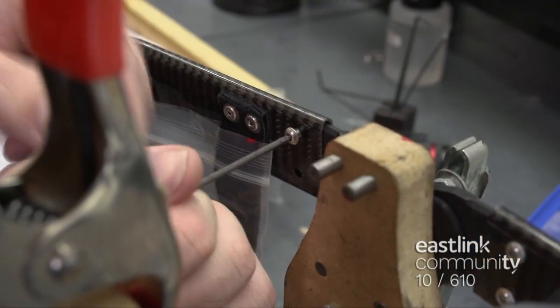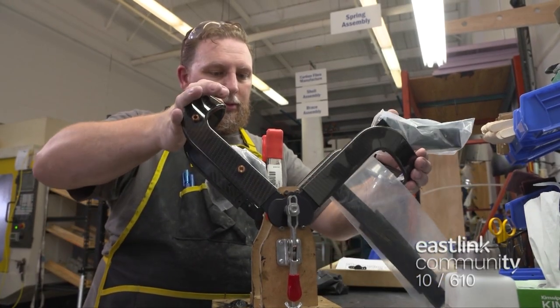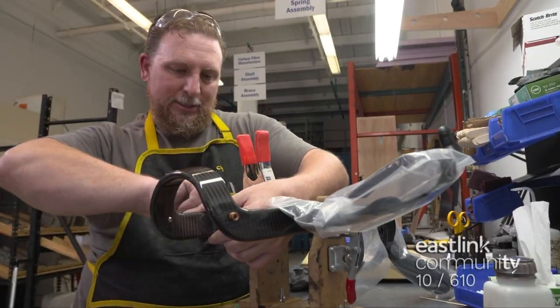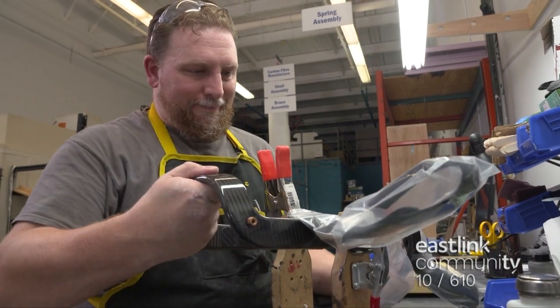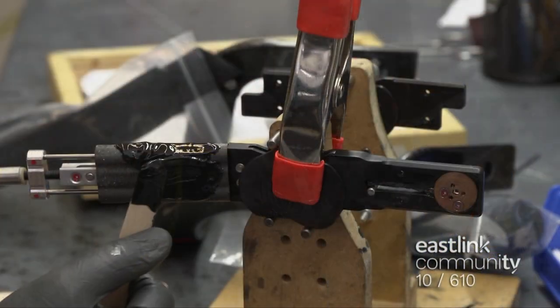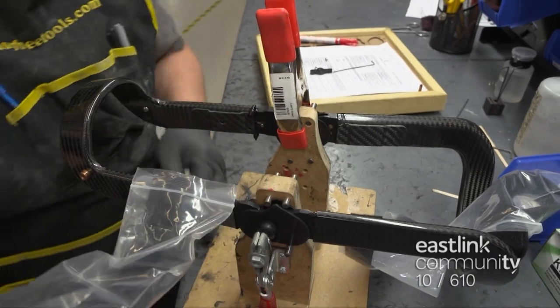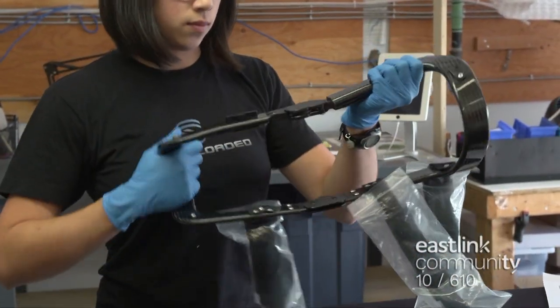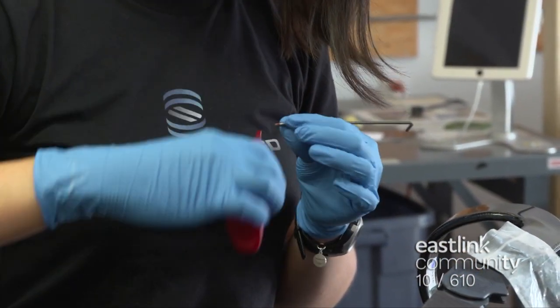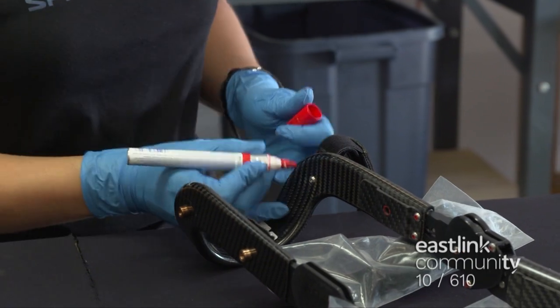Screws are inserted and tightened at each connection point. The hinges are checked to verify a smooth drop motion. The high-power mode is set and the hinge motion is checked again. Each brace is assembled and tested in this dry-fit process, then reassembled with epoxy and screws for a true bond. An engineer checks the adjustment system on the hinge and the function of the brace. Loctite is added to each screw and then tightened. Each screw is marked red to indicate it has been tightened properly.